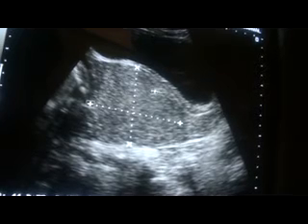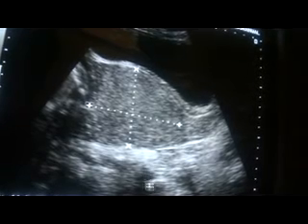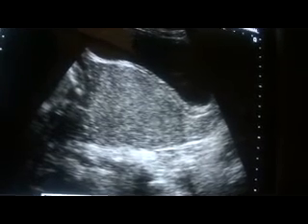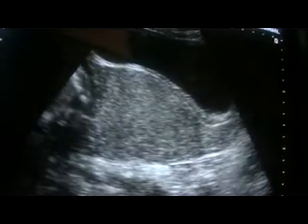So this is a questionable area relating to the cervix of the uterus.